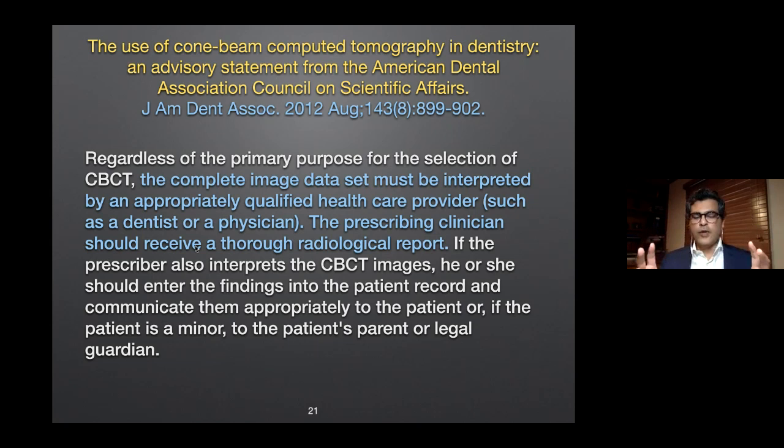If you think that you are qualified, you're confident enough, you are trained enough that you can interpret the whole volume, then that's fine. But if you're not confident, if you're not comfortable reading the whole volume other than the region of interest, then of course it is better to send out the scan to a radiologist. It could be an oral maxillofacial radiologist, or it could be a medical radiologist. Both are qualified to give you a comprehensive report of the CBCT scan.